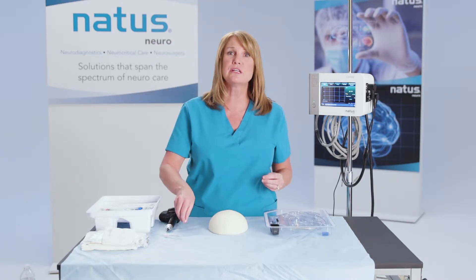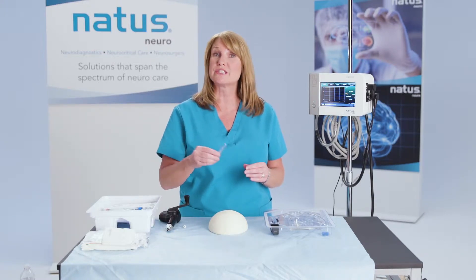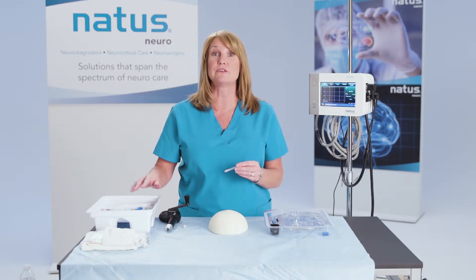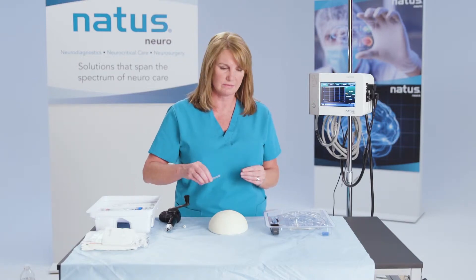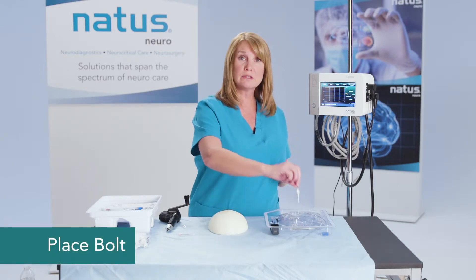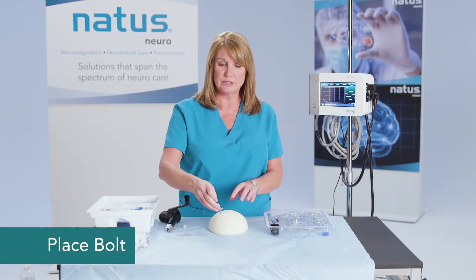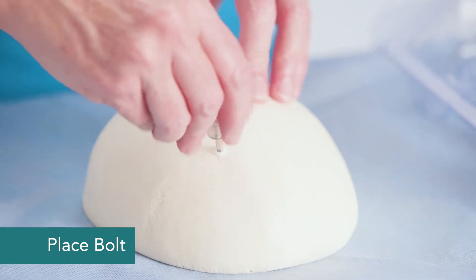The next thing you're going to need to do is open the dura. That can simply be done with an 18-gauge needle or a spinal needle, whatever's convenient for you in your cranial access kit. Then you'll want to place your bolt — pick the bolted system up exactly as it is in your kit, and screw that into the skull itself.